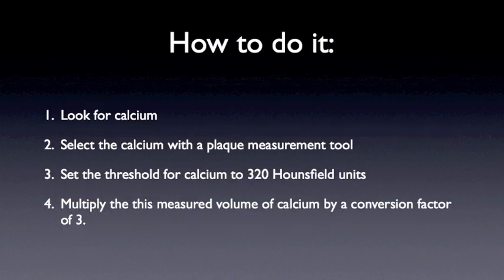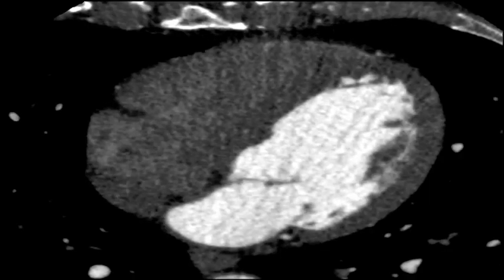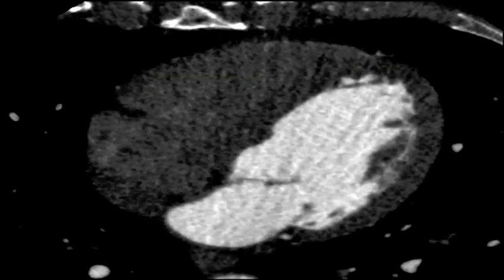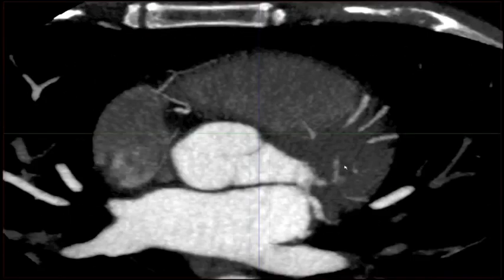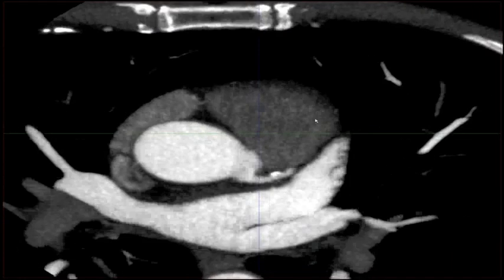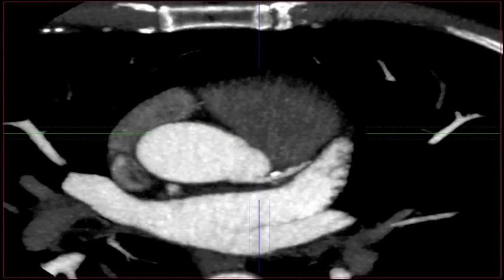Firstly, find the calcium. The best thing to do is to reduce the window level and increase the window width a bit, increase the MIP, and carefully scroll through and look for calcium. In this case, we can clearly see some calcium in the proximal LAD and there's no calcium elsewhere.